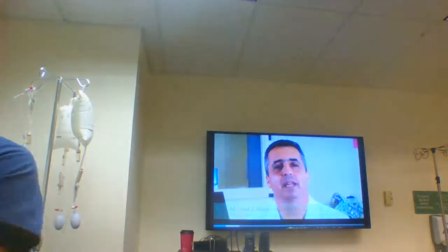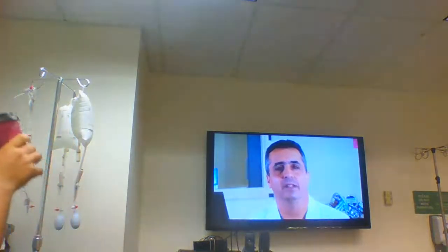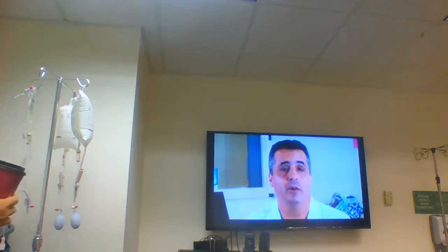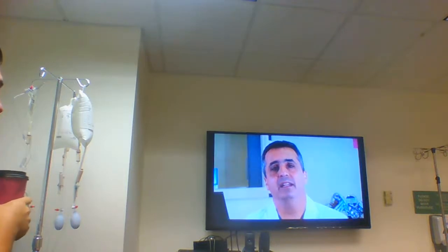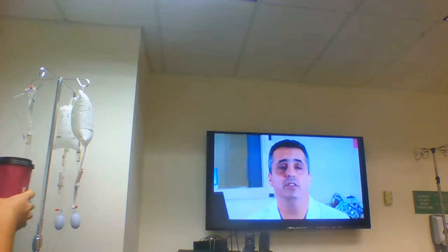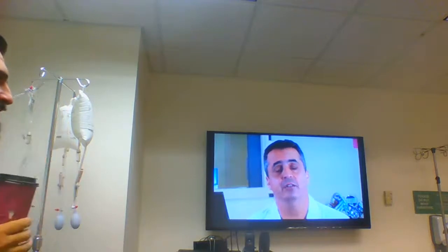The TR band is used to apply low pressure hemostasis at the site of the radial artery access and sheath. We'll discuss the importance of the Barbeau and the reverse Barbeau test as it pertains to placement of the TR band. And the reason why we maintain low pressure or patent hemostasis is to attempt to reduce the incidence of radial artery occlusion following radial artery catheterization and angioplasty.